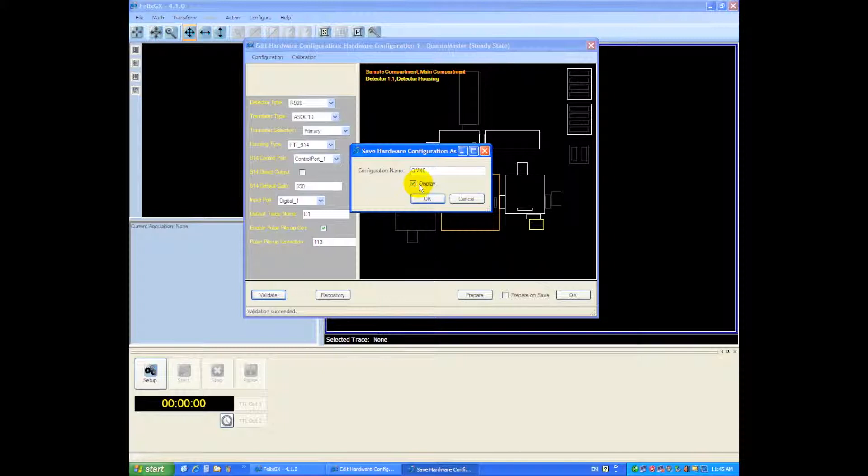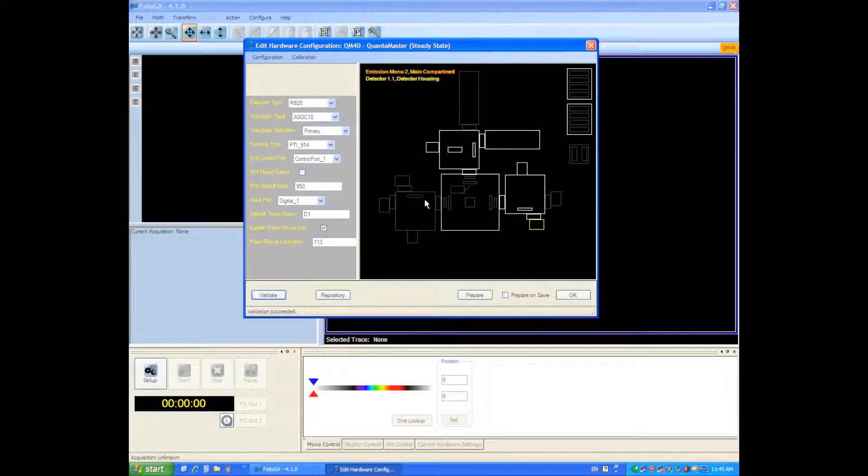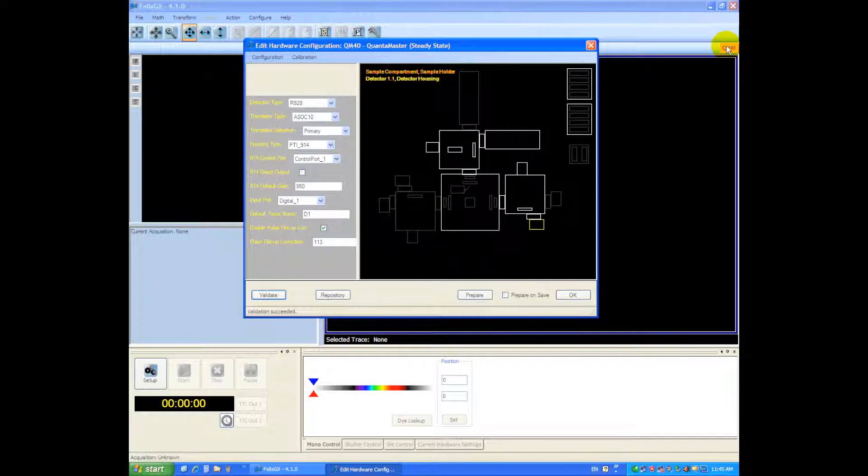This display checkbox will cause the configuration to display over here on the toolbar so you have quick access to your hardware configuration.